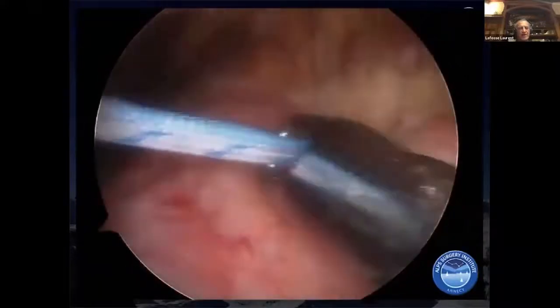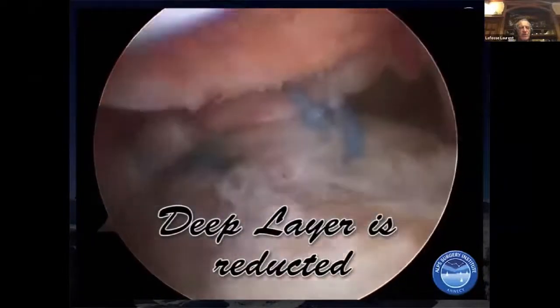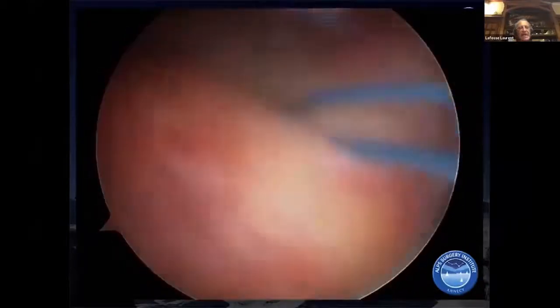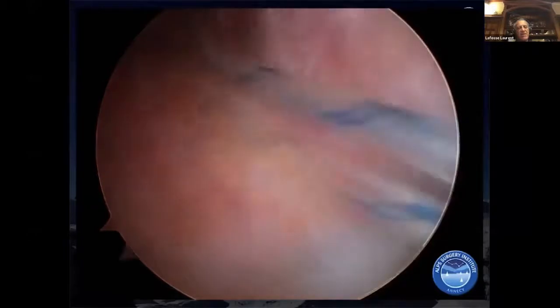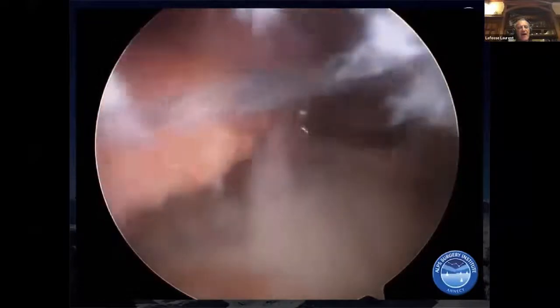But what is important to understand is that when you pull the knot, the post will be the thread that goes to the anchor without the lasso. It means that you will pull on that post in order to bring the lasso to the anchor and to use the anchor as a pulley. And you see that we really restore the anatomy. And it's not only to restore the coverage of the tuberosity, but it's something that will really restore the entire anatomic insertion of the rotator cuff.